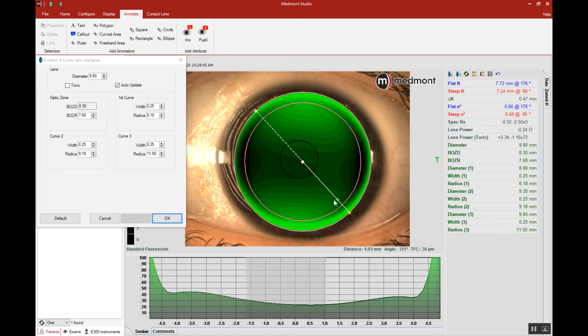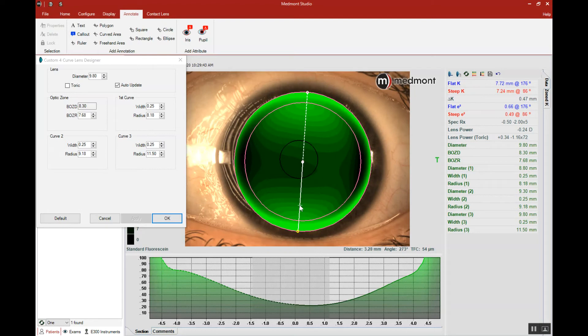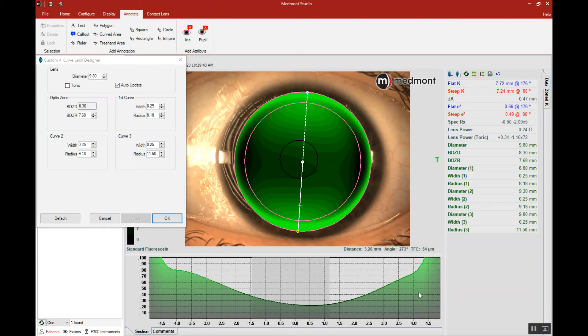Let's take the axis line to the steep, and here you see a fluid layer that's getting ever thicker and thicker and thicker.